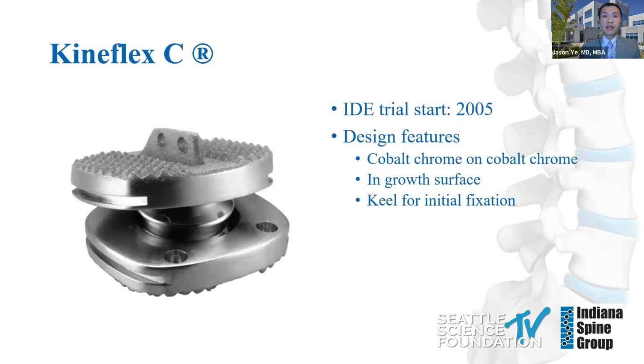There were some implants that entered IDE trials but never made it to market. The Kineflex C entered IDE trials in 2005. It featured a cobalt chrome on cobalt chrome articulation. The initial motivation for this type of bearing in total hip was that it had better wear characteristics and did not produce the polyethylene wear particles that caused osteolysis. However, early reports of cervical arthroplasty showed that osteolysis was not as prevalent in cervical arthroplasty compared to total hip. This may be due to the far smaller forces in the neck versus the hip.